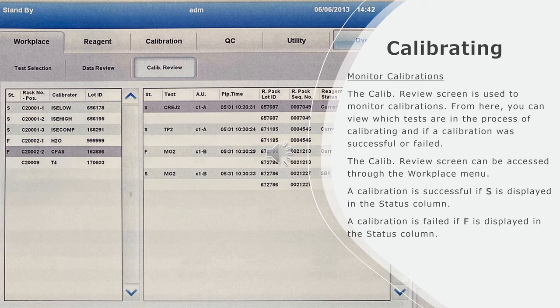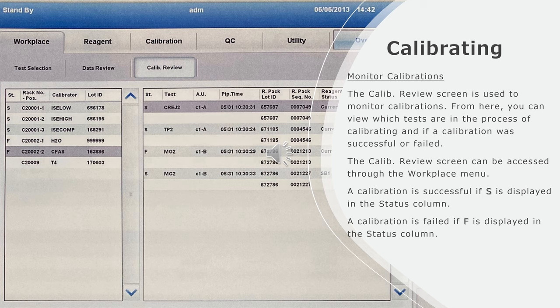Monitor calibrations: The calibration review screen is used to monitor calibrations. From here, you can view which tests are in the process of calibrating and if a calibration was successful or failed.